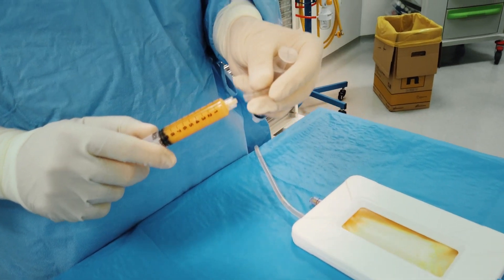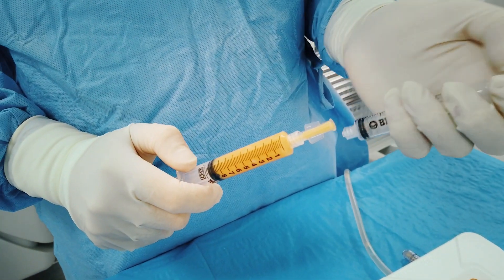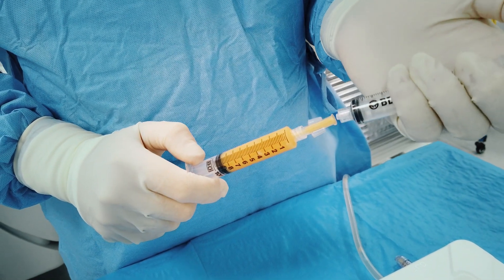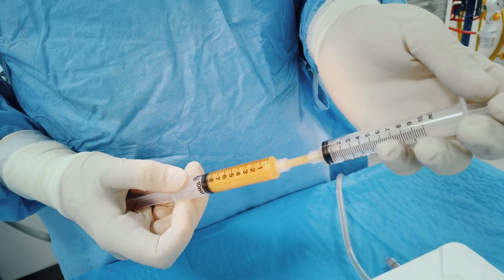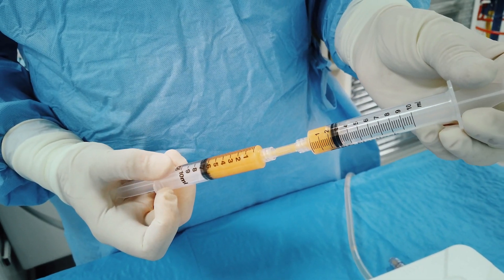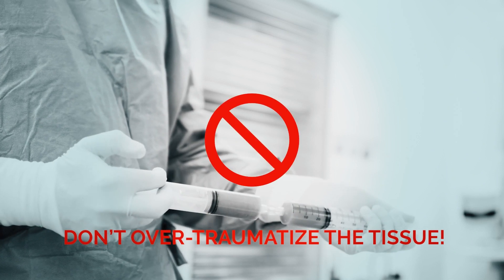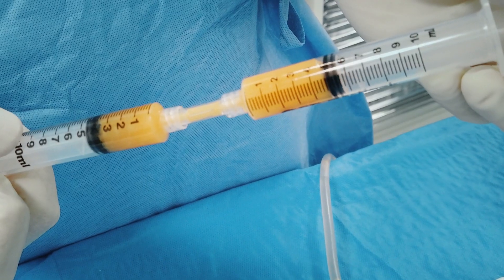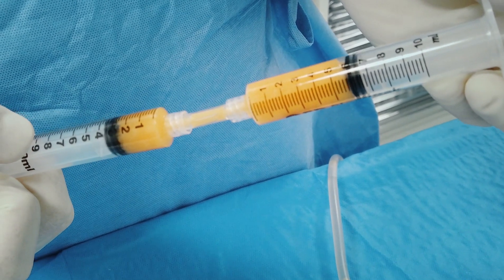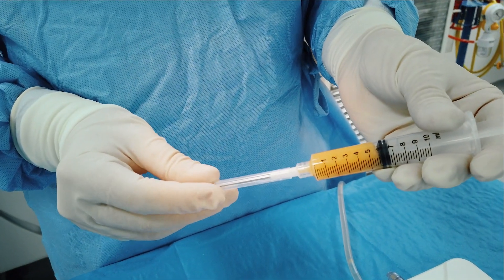Connect a 10 ml syringe to the out-luer lock connection and collect the final product. It is recommended to not manipulate the tissue any further. Do not squeeze it from one syringe to another. If the final product is very dense, you can gently transfer it to smaller syringes with the provided connector to facilitate the injection. Don't over-traumatize the tissue. It is possible to use the needle provided within the kit or any other needle with a recommended diameter of 18 gauge.